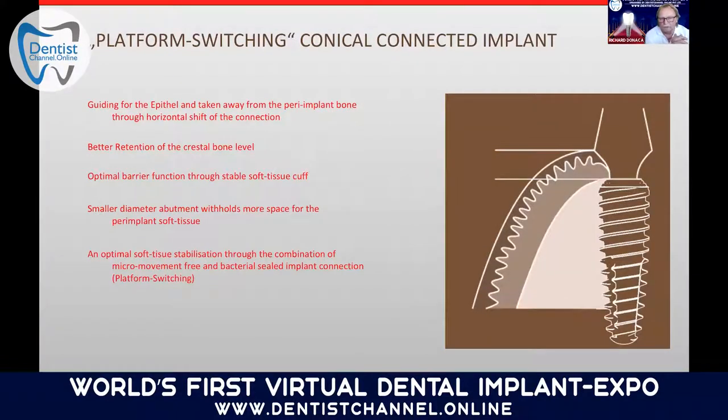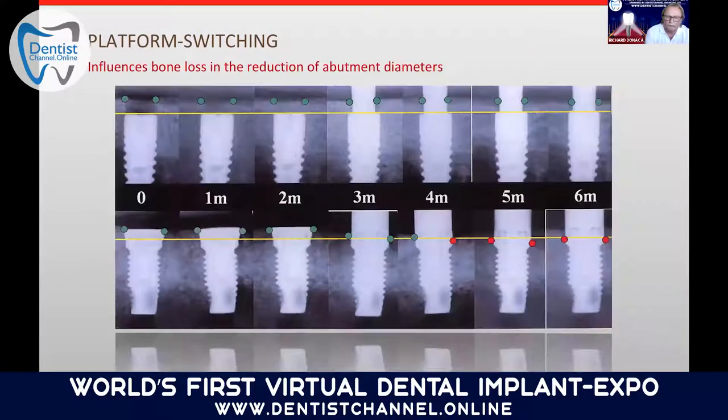On platform switching conical connected implants, you have a guiding through the epithelial and taking away from the peri-implant bone through horizontal shift of the connection, a better retention of the crestal bone level, an optimal barrier function through the stable soft tissue cuff, a smaller diameter abutment that withholds more space for the peri-implant soft tissue, and an optimal soft tissue stabilization through the combination of a micro-movement free and bacterial sealed implant connection, more or less the platform switch. There have been studies done, of course, on the platform switching and on the conical connection. Yes, even on a wide conical connection, if you reduce the diameter of the abutment, it will reduce your bone loss levels, but it still does not solve the problem in total.